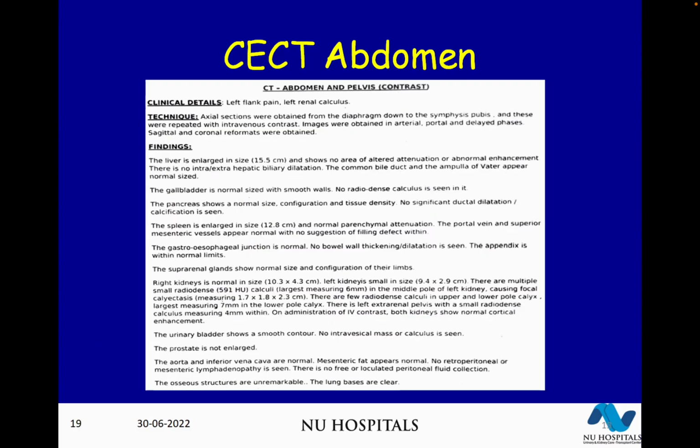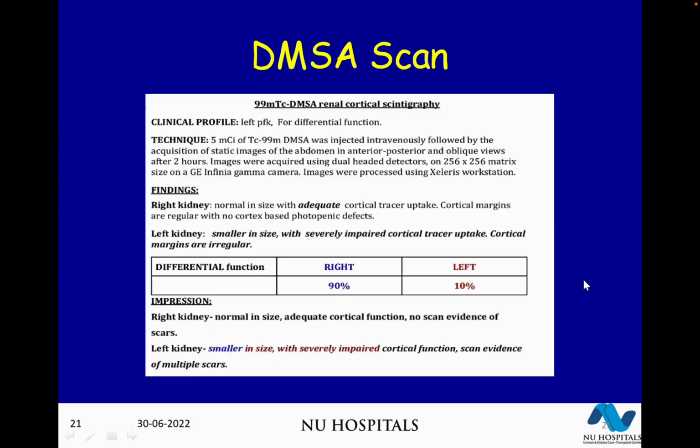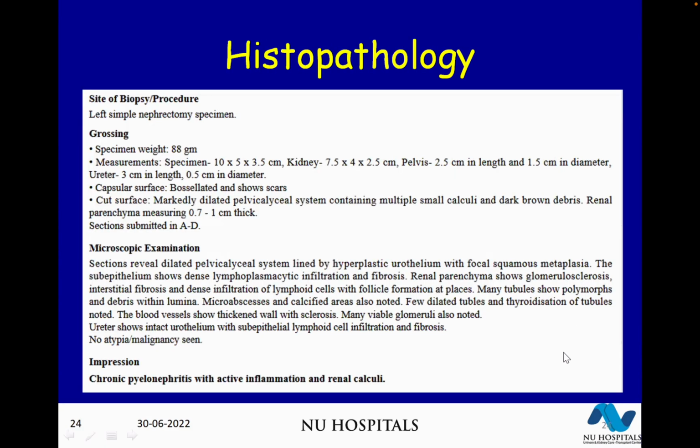Sorry to cut you short. 9 centimeters, left kidney. And look at the pathological size: 7 centimeters. Go back to the pathology. Measurement 7.5 centimeters. Which is more accurate, the CT or this measurement size? Why is the kidney looking bigger on the CT and smaller on the gross? Why is the kidney looking bigger on the CT scan report and smaller in the gross specimen?